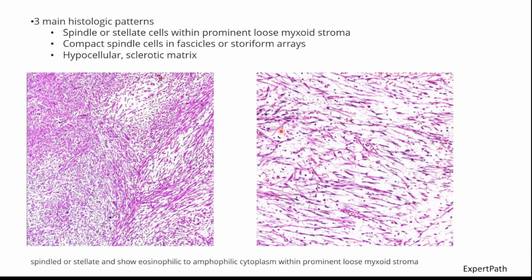The characteristic cytology feature is that the cells look spindly, with open chromatin. Usually the nucleolus is not that prominent, but we can still see punctate nucleoli. And the cytoplasm is kind of amphophilic, light purplish.